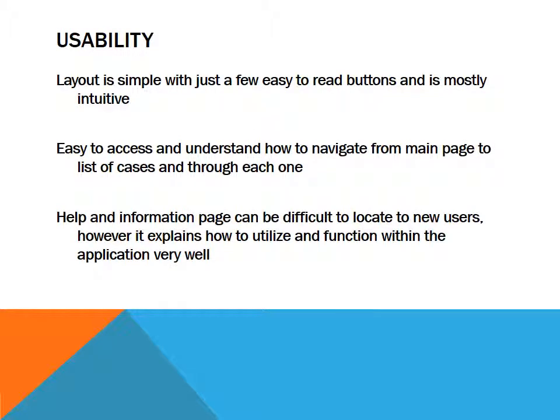This is a very simple to use application. It opens to its homepage, which has only a few buttons to use. One leads to the help page and application information. Another turns on and off answers, and the final one takes you to the list of cases to practice with.